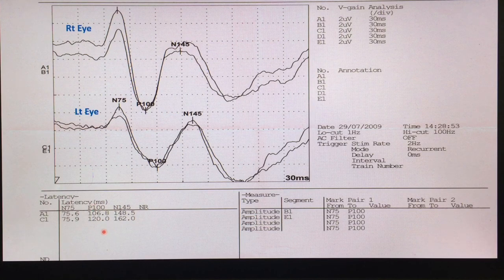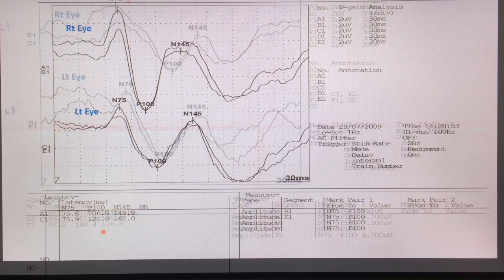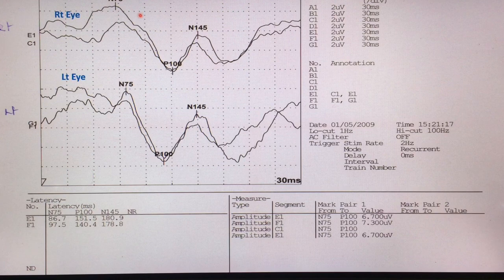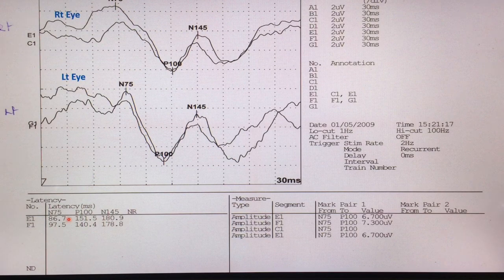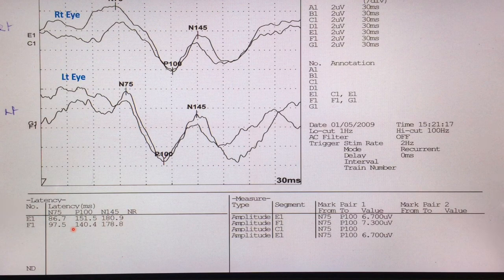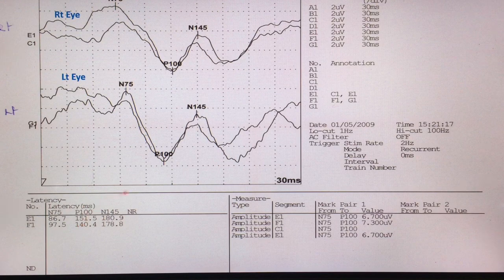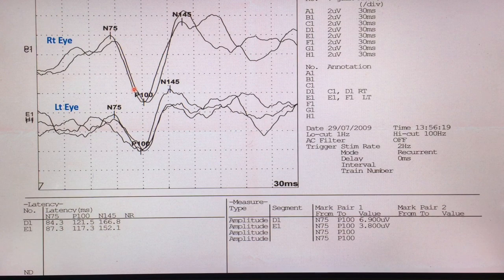This case shows slightly abnormal morphology with delayed latency from both sides — right side 151.5 milliseconds, left side 140.4 milliseconds. The P100 interpeak latency difference is 11.1 milliseconds. Amplitude is not that bad, and there is a normal NPN complex on the right side.